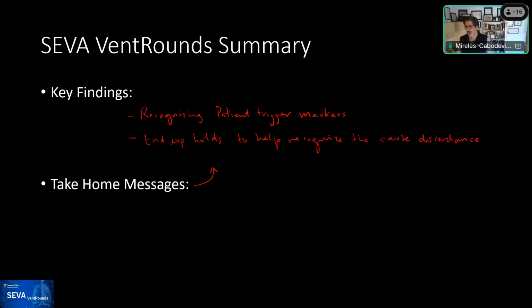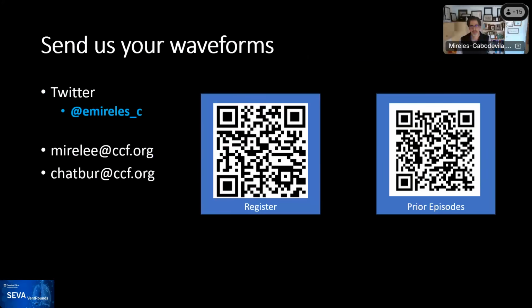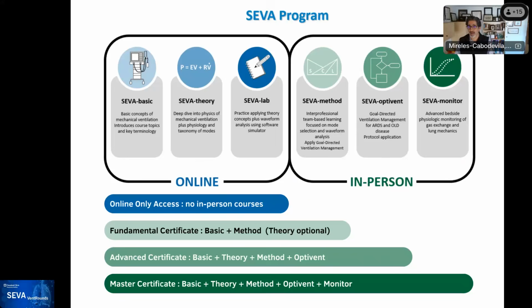Yeah, good job, Ariel. Yes, you always want to check and examine your patient to be sure who and how is triggering. Again, here's the CME for our CCF caregivers, the CRC for our RTs. Send us your waveforms. As you see, we'll highlight your team, highlight yourself. If we get your waveforms, it helps us grow and learn. There is no boring waveform. I'm still waiting for one in which I don't have anything that I can say. Perhaps even if it's a blank screen.